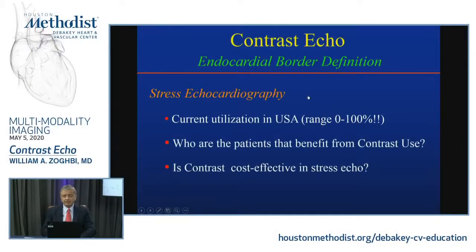Utilization in the United States has a nice range of 0 to 100%. I think it's still valid, truly, because some laboratories are not using it at all. Some laboratories are almost mandating it. I think the truth lies somewhere in between, because if you mandate it on images that are pristine, you may have degradation of images. And here, if you do zero, you're missing a lot on good accuracy.